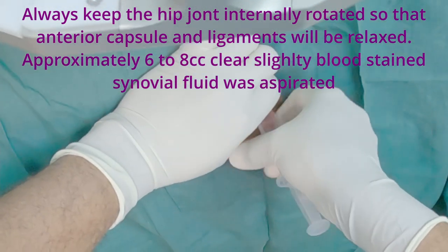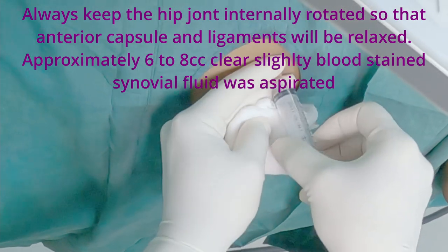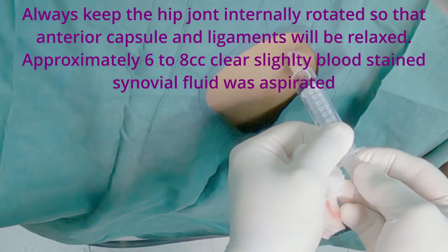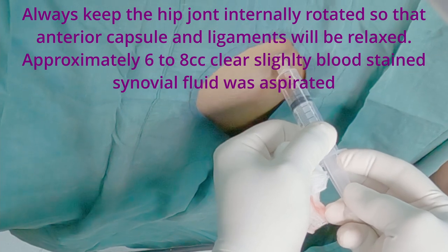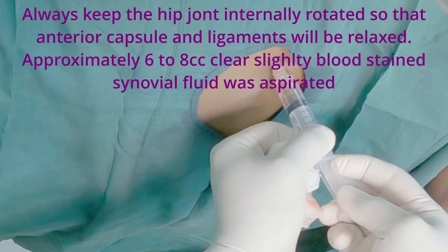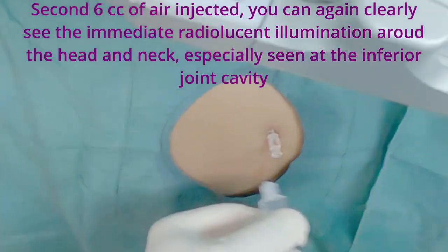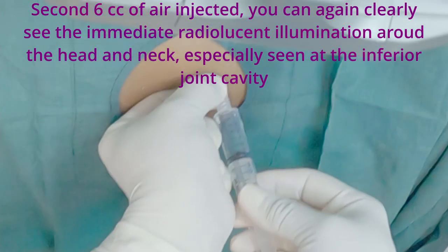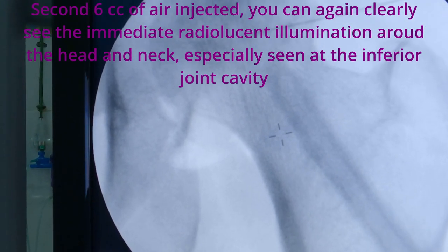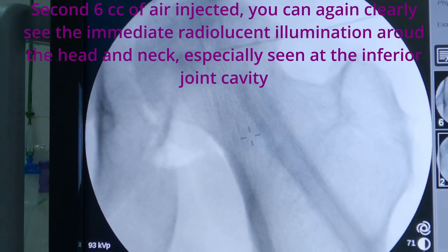Approximately 6-8 cc's of clear, slightly blood-stained fluid was aspirated due to effusion in the osteoarthritic hip joint. This again confirms that the tip of the needle is inside the hip joint cavity.